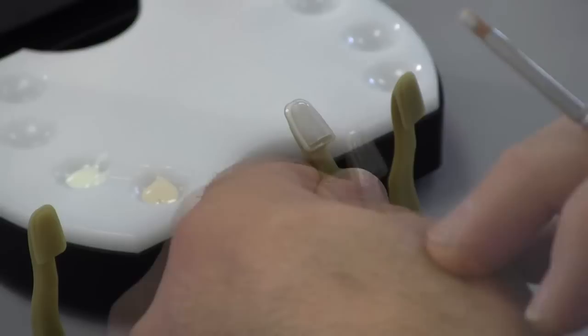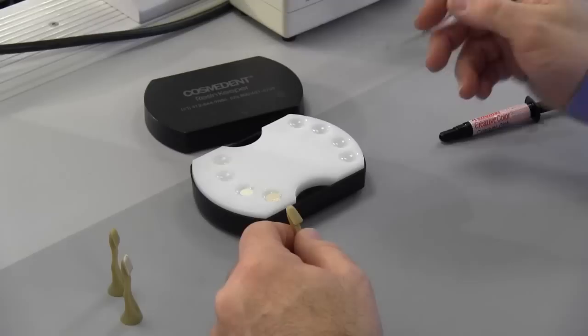So we're going to polymerize this for 10 seconds. Next we're going to apply the Creative Color Pink Opaque, and you can see you want to put that on in a nice, even coat.